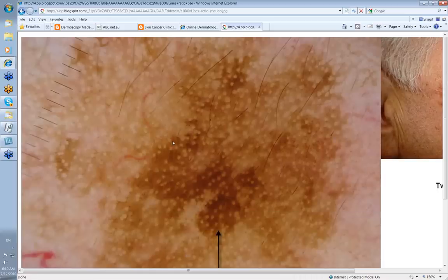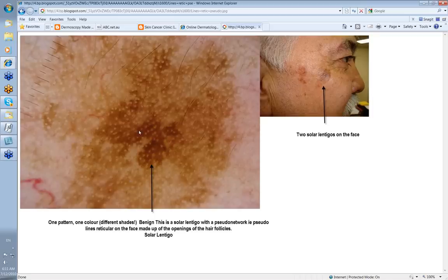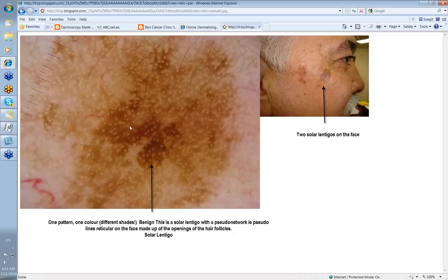Another important case: a gentleman with a couple of pigmented lesions on his cheek — in fact solar lentigos, not lentigo malignas. One pattern, one color, admittedly different shades, but benign. Here you've got a pseudonetwork that looks like lines reticular, but the holes you're seeing are the openings of the hair follicles on the face. On the face the epidermis is flattened — you don't have prominent dermal papillae and ridges — so you don't get the contrast and thickness of cells that would give you true lines reticular. What you get is a pseudonetwork made up of the openings of the hair follicles.